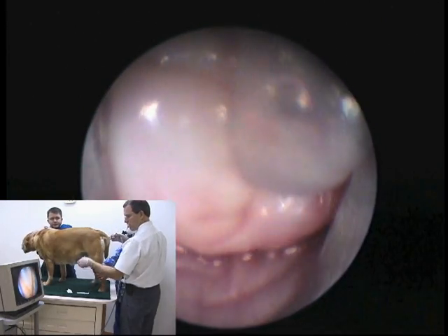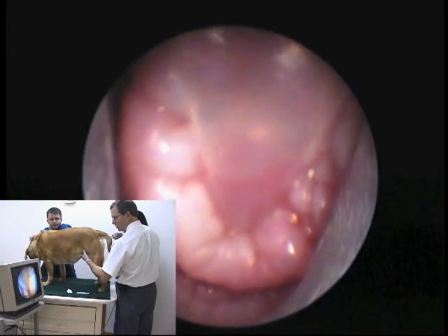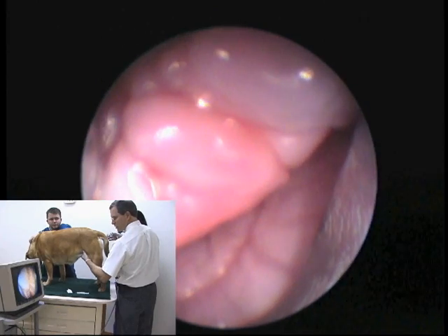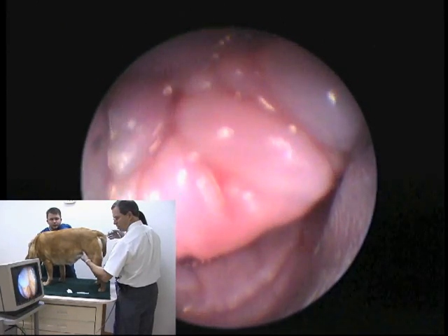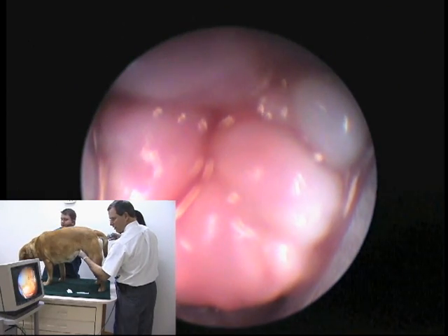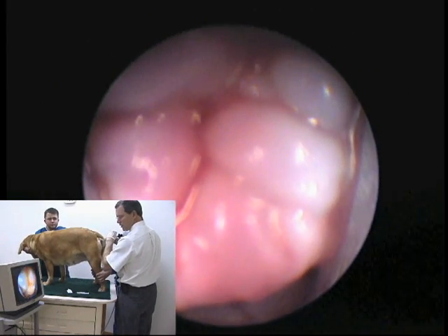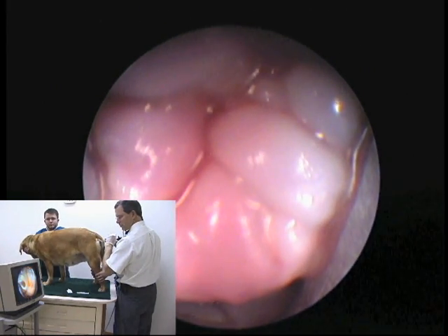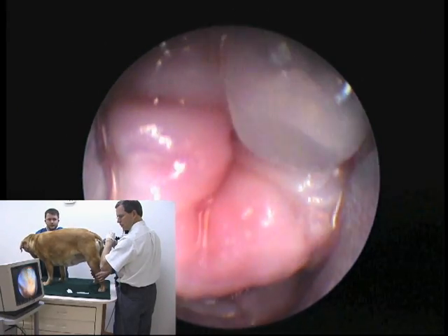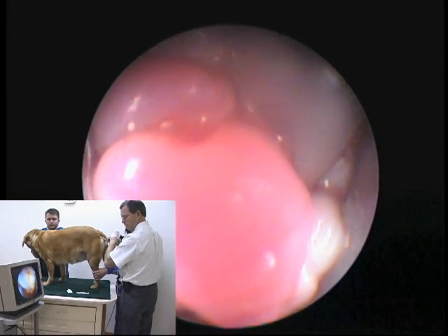As we go down the cervix, the os will generally be aimed ventrally and we will hit the os to the cervix with the catheter. If we can't get the catheter in, we slide the scope ventral to the opening, trying to keep the opening directly in the dorsal position of the scope, and then advance the catheter again. You do not have the ability to aim the catheter in any direction, so the catheter has to be straight at it. The scope going ventral to it tips the cervix up a little bit, allowing the catheter to immediately enter.